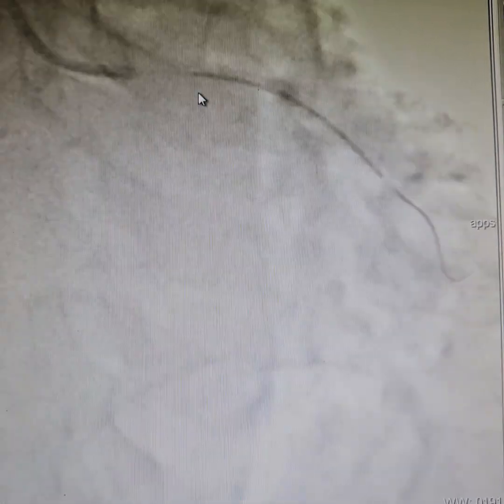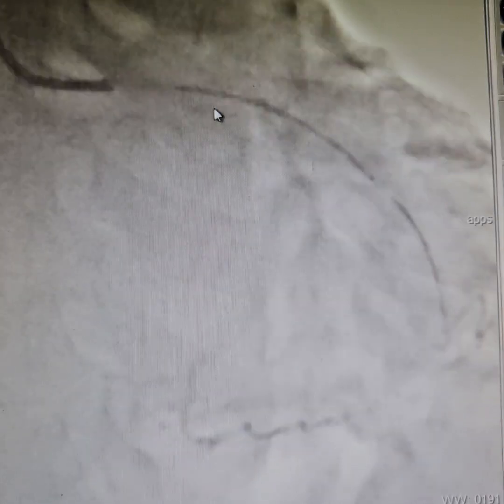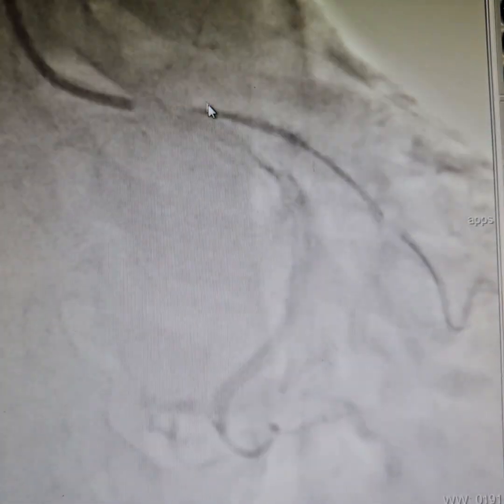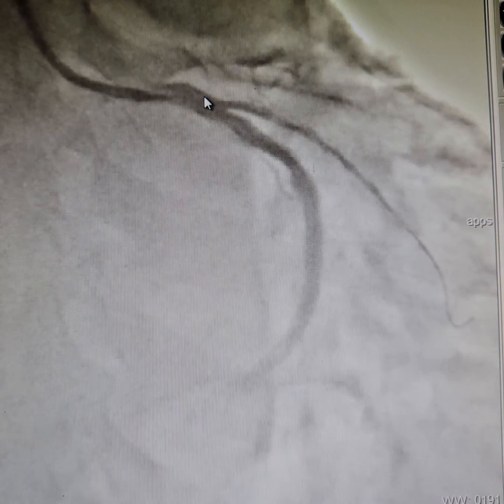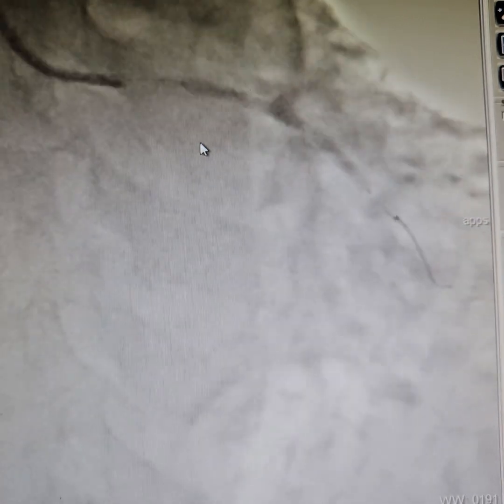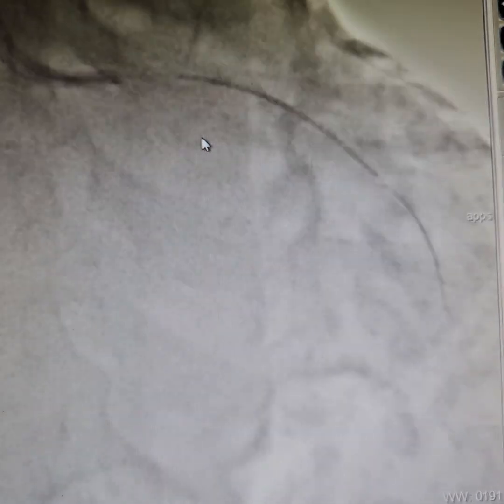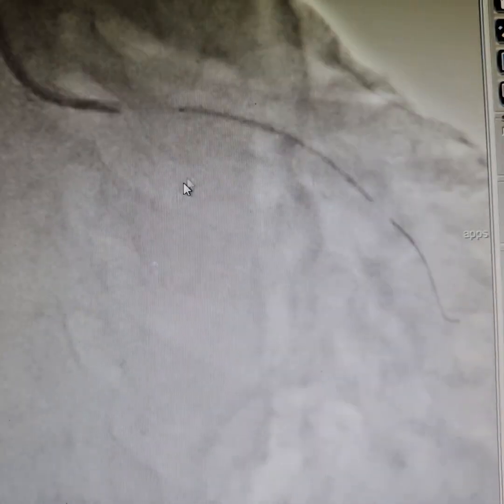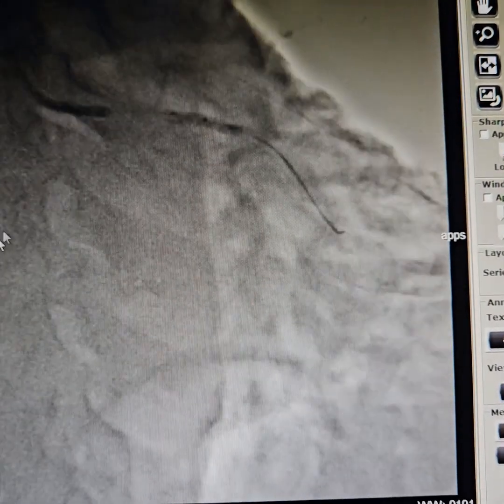The origin of the obtuse marginal is a little diagonal, so the leading edge of the proximal part and the distal origin are a little apart. You position your stent so that you do not miss the ostium — take about 0.5 to 1 mm inside the main artery. We've inflated the stent as you can see here.